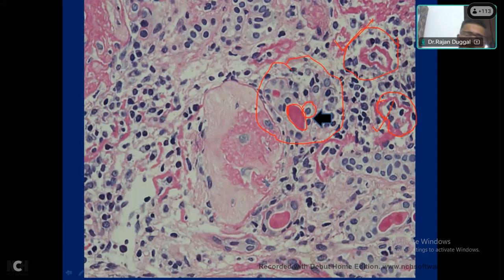Okay, as you people who do histopathology remember, we see this in endocrine cells. They show nuclei with a halo around them. And you also see this kind of halo if you report lymphomas: monocytoid cells or marginal zone lymphoma show this kind of a halo around it. Hairy cell leukemia, you can see this kind of halo appearance.